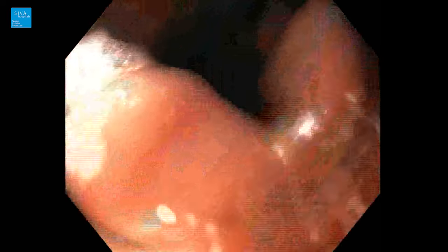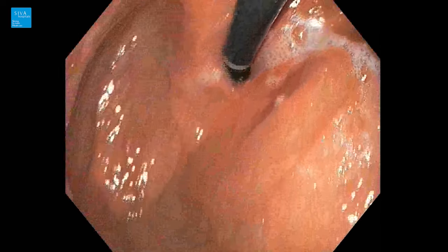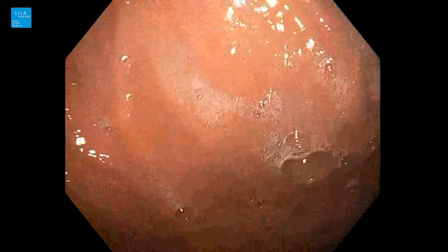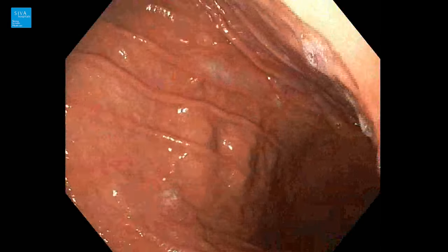You can see the fundus of the stomach — mild inflammation in the fundus. We need to look for hiatus and I'm looking for any hiatal findings. You can also see the body of the stomach, which also appears inflamed.